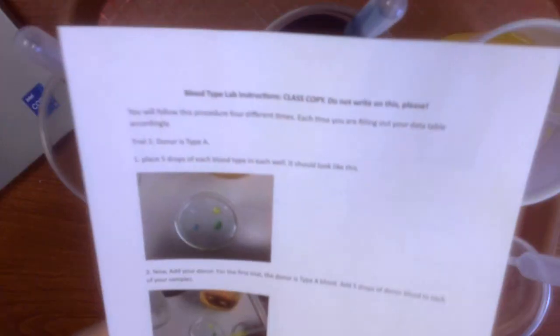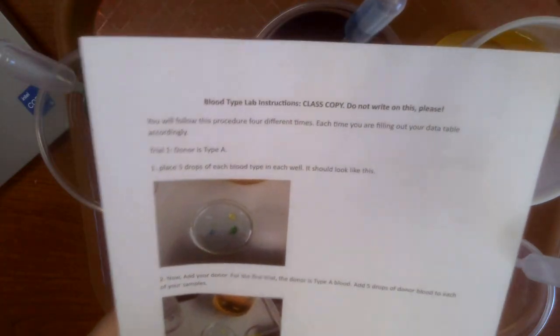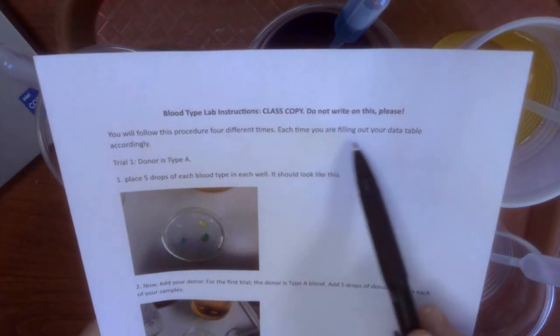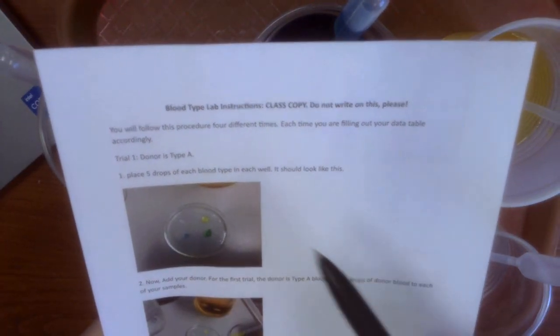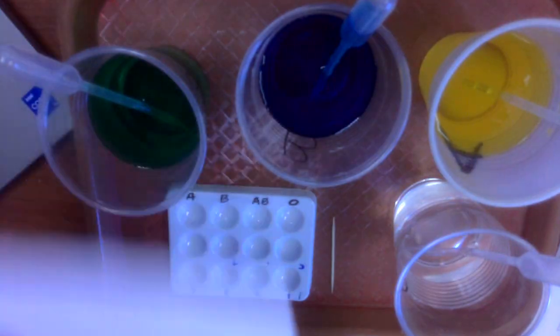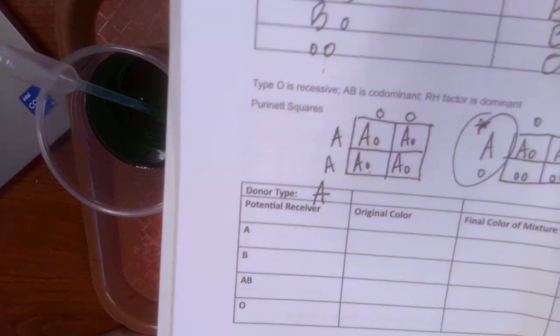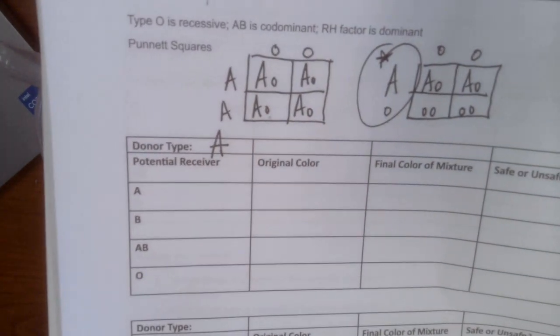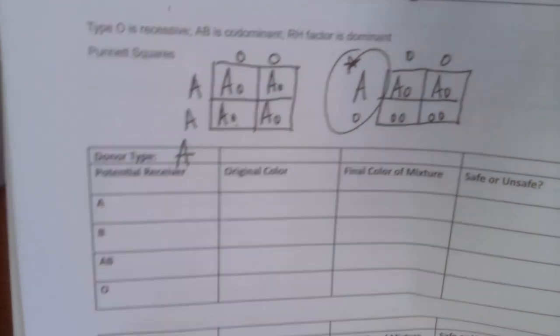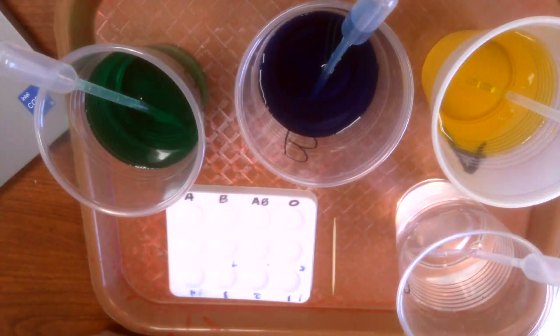You're going to be following this procedure 4 different times. Each time you're filling out your data table. Trial 1 donor type is type A. So we're going to do this together. In my first data table, I'm going to put type A as my donor type. You'll notice that I have all of the potential receivers. I have the original color, final color, and if it's safe or unsafe.